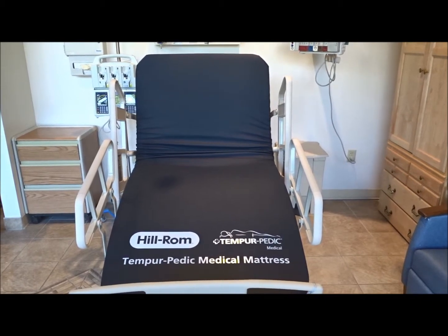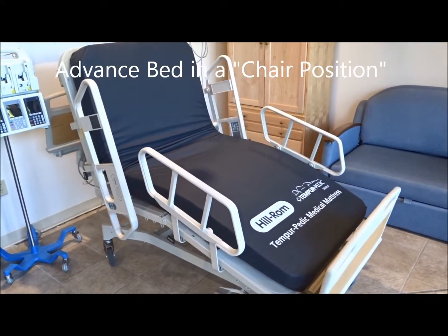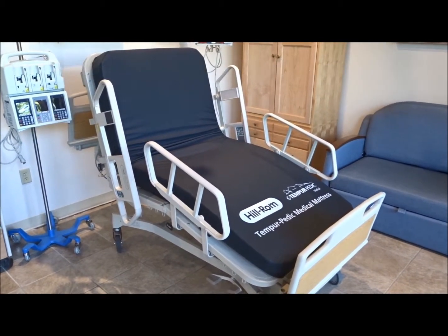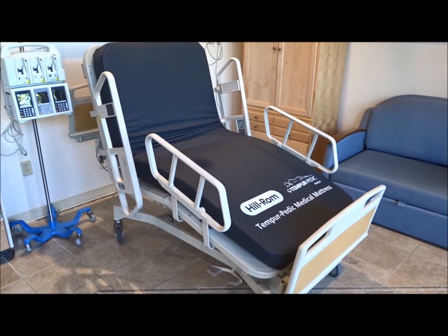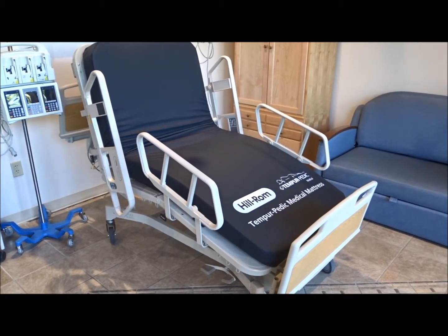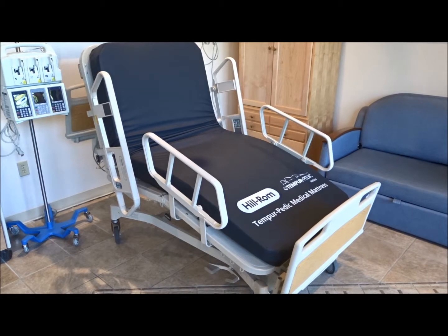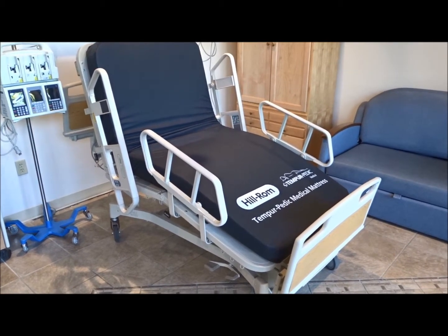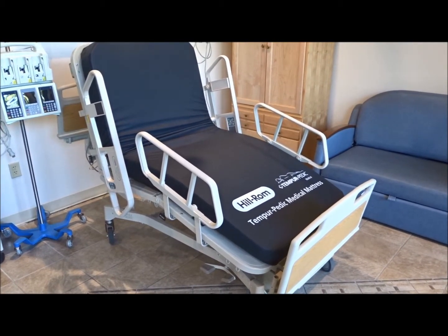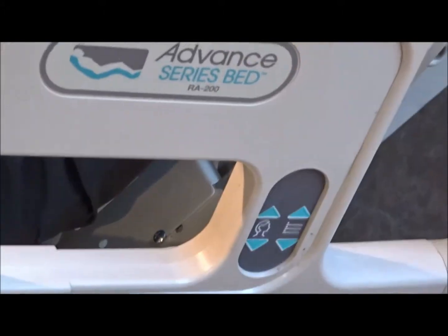We're going to take it through some additional motions here and show you more functionality. Right now the Hillrom Advanced Bed is in the chair position, which is ideal for sitting people upright. When a person sits upright they have better bodily circulation, which is ideal for increased circulation and bodily health. This chair position is set up for the patient while they're in bed — it's an upright position for watching TV, eating in bed, and it helps people recover faster.